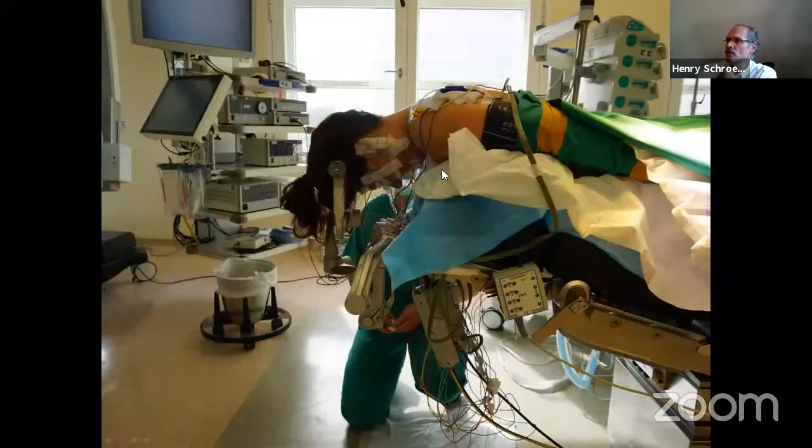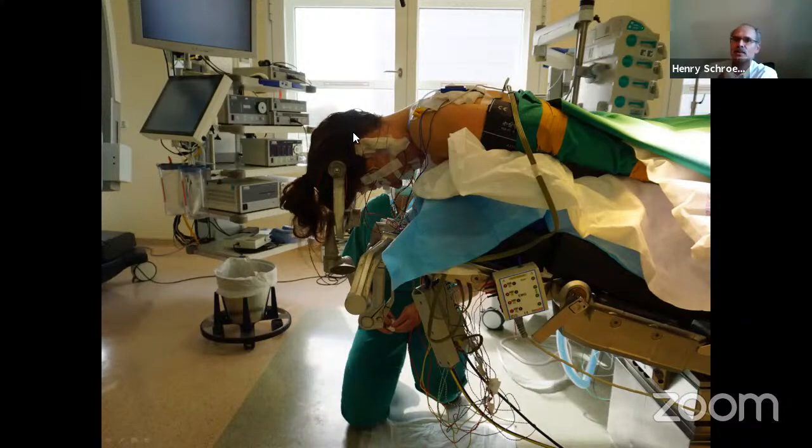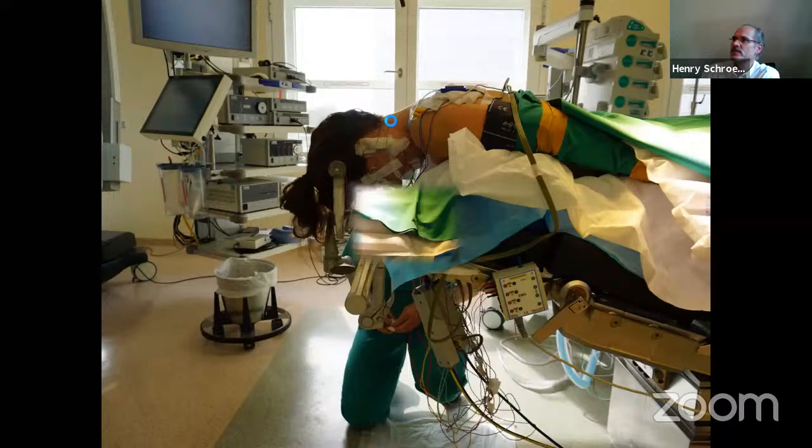Positioning, you have already heard about it. We also use this Concorde position so that we have a good view into the posterior fossa. When I was young, I looked from this side. Now I'm old and have knee problems. I sit here and look from this side upside down because it's more convenient. Only if I cannot look far up, then I come from here and look up to the fourth ventricle. But usually it's fine in this way.